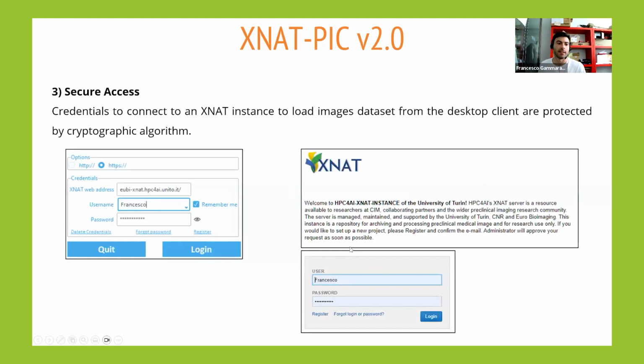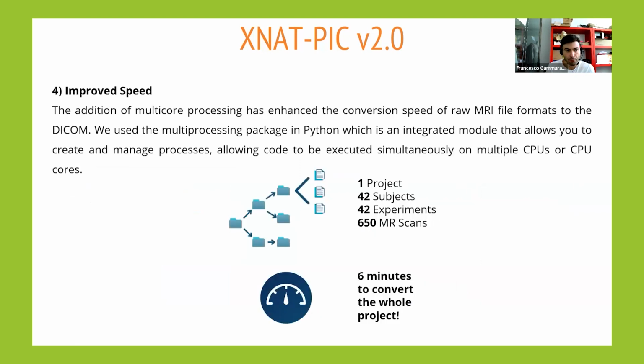The credentials such as the IP, the username, and the password to connect to an XNAT instance are protected by a cryptographic algorithm. The figure on the right shows you our XNAT instance called Euro-BioImaging.